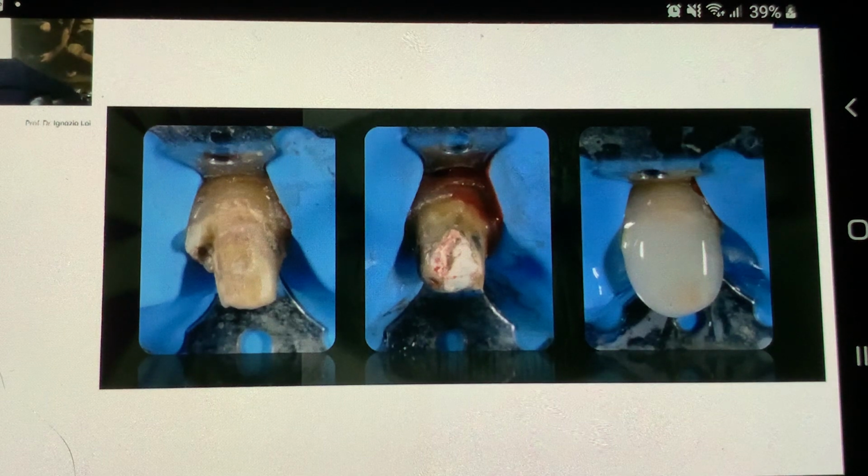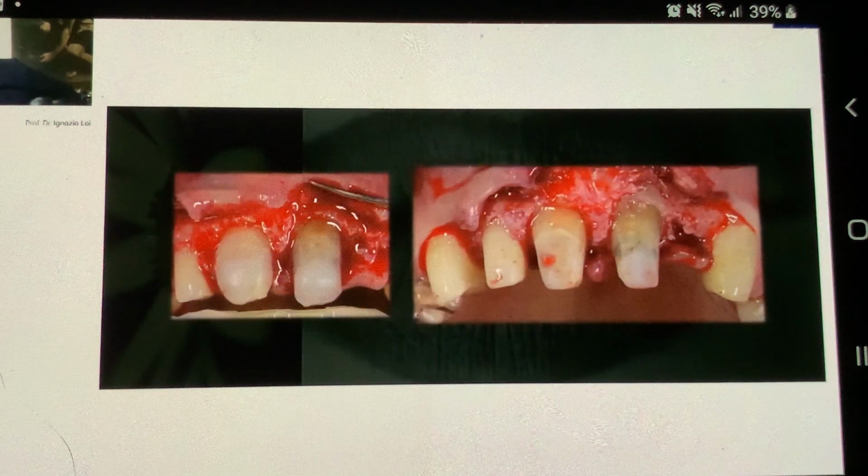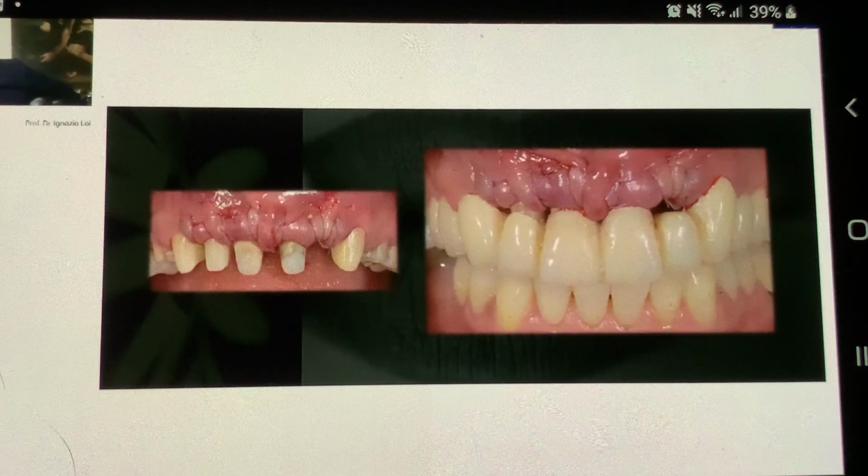which would allow us, after reacquiring a certain volume, to prepare these teeth, eliminating all the finish lines here, for example, and the defects, recreating vertical walls without involving the crests, so that with the finish line, now we can go back to the coronal part. So distancing new CEJ by 3 or even more millimeters from the crestal structure, but towards the coronal part. So recreating a space so that the width recreates towards the coronal part.